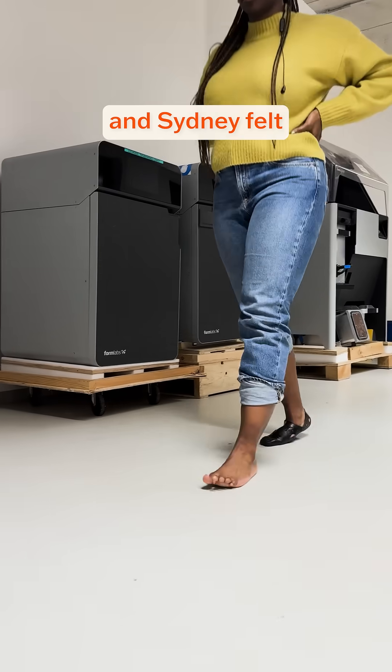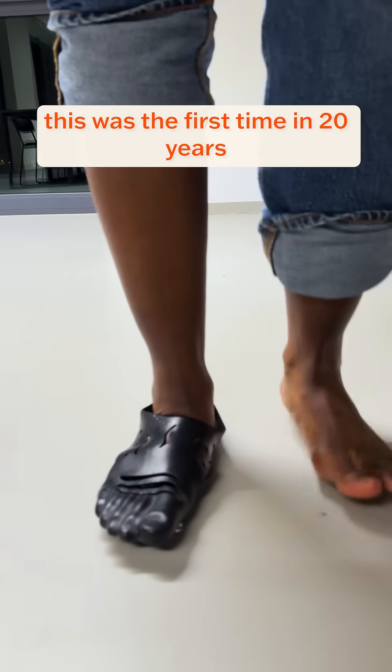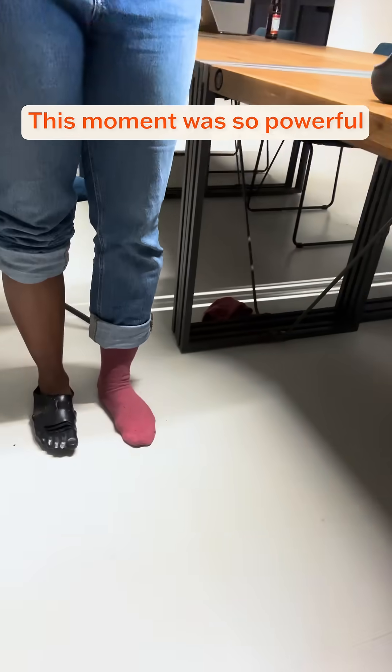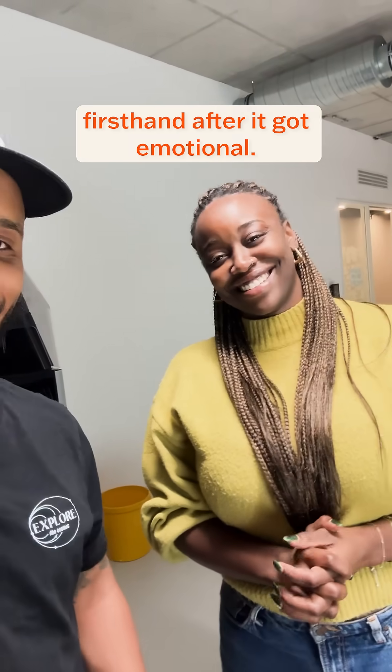The new design fit perfectly and Sydney felt an immediate improvement in both her gait and overall comfort, saying that this was the first time in 20 years where she could feel her foot again. This moment was so powerful that she broke down in tears, and this is her reaction firsthand after it got emotional.